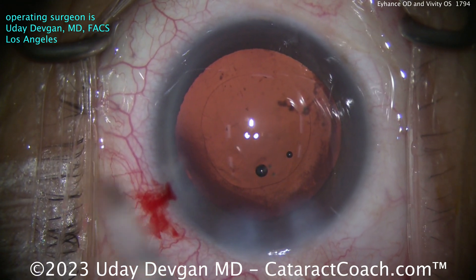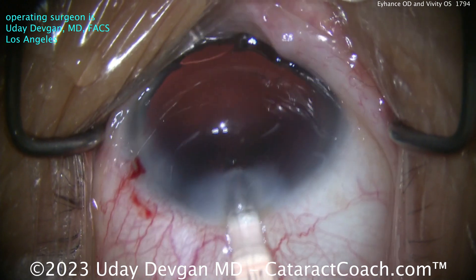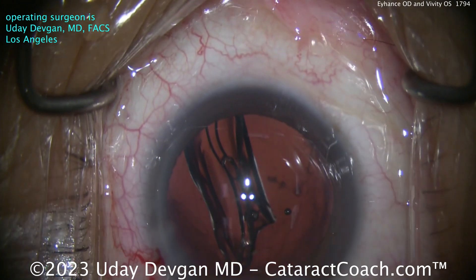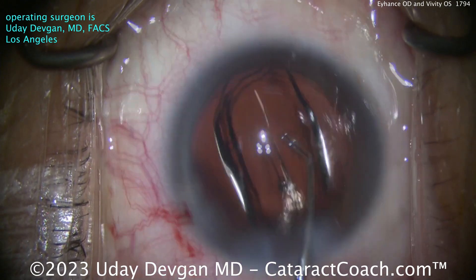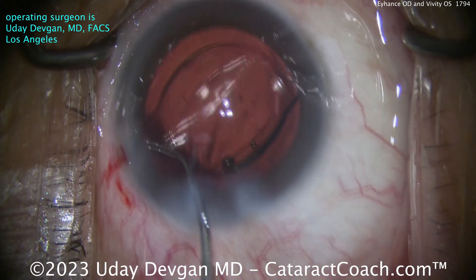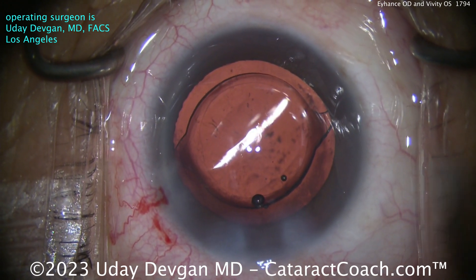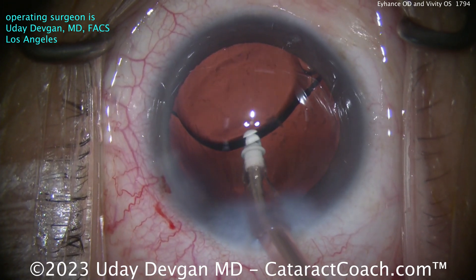Dominant eye — nice looking rhexis, clean up that capsule bag pretty nicely. Here comes the IOL being delivered. Watch carefully, we're delivering an iHance lens, this is the Johnson & Johnson Tecnis iHance lens. It is a monofocal lens — do not be confused, it's a monofocal lens. It does have a central one millimeter zone that may have a little extra curvature or spherical aberration giving you maybe a pinch more depth of field, but it's very minuscule. I'm happy to put this in the patient's dominant eye because it has very little compromise compared to the ZCB00 lens — the distance vision is just about as good.